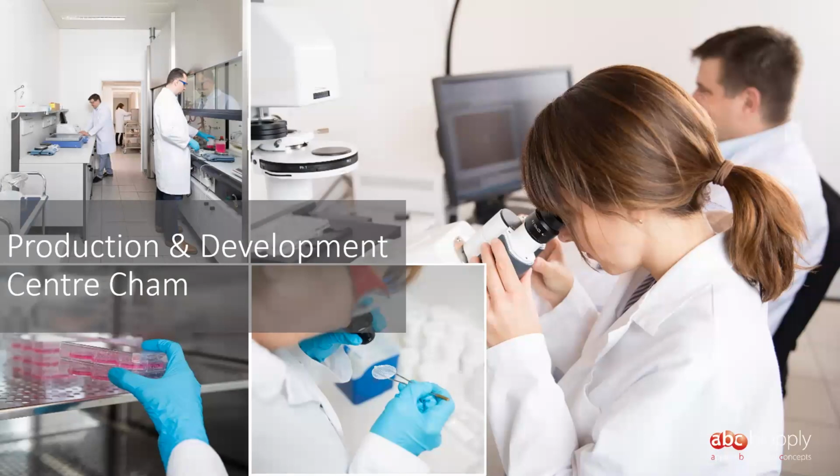The first question I would like to answer is whether it's possible to tune the agarose concentration depending on the cell type to be used. That's a very good question. We've actually tested a range of different agarose concentrations in the past, and we have not really observed any differences in the concentration of agarose on cell growth, aggregation, and so on and so forth. In fact, agarose, fortunately, is so biologically inert that it seems really not to matter how concentrated it is. We therefore chose a concentration that makes handling of chips easy and nevertheless is transparent enough to use it in microscopy.